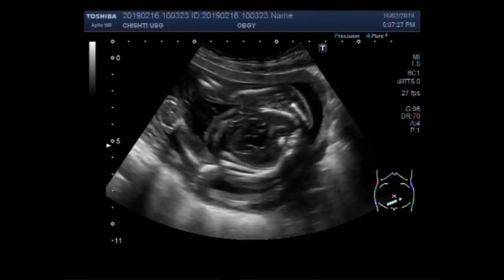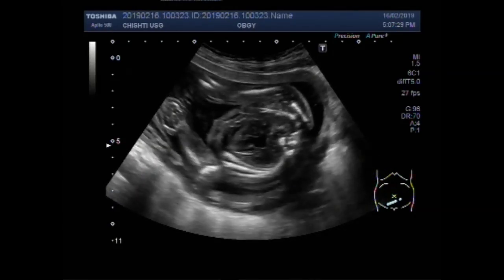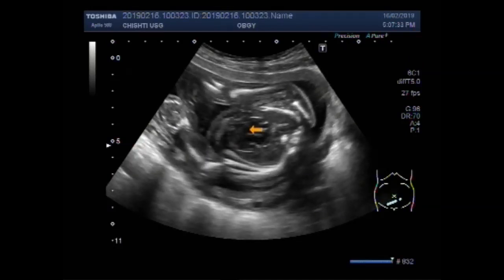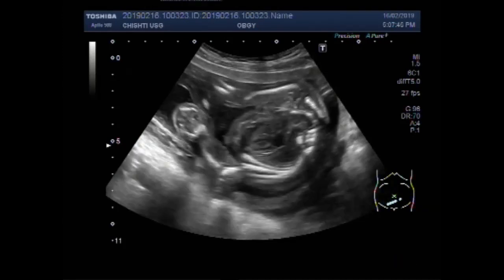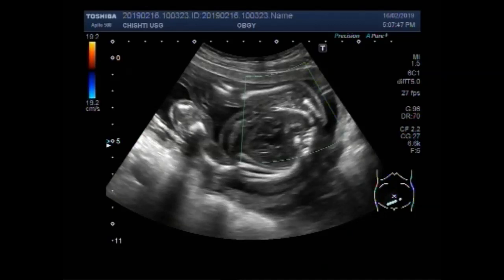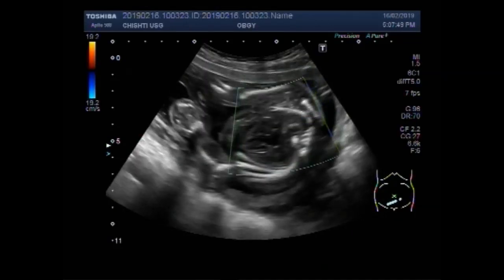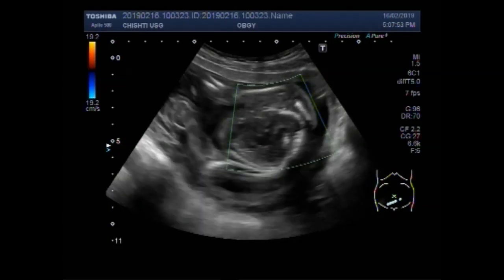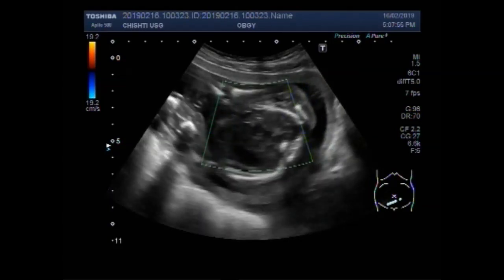Now you can see the fetal abdomen and chest. No fetal cardiac activity is visible or audible. This is the fetal heart. No blood flow is seen inside the fetus or in the umbilical cord.